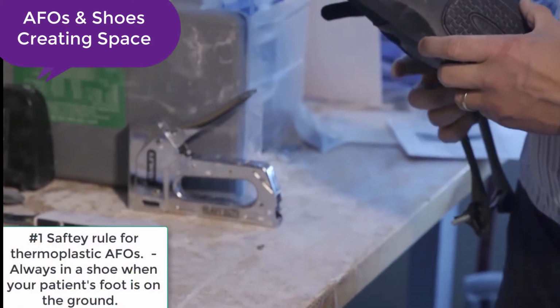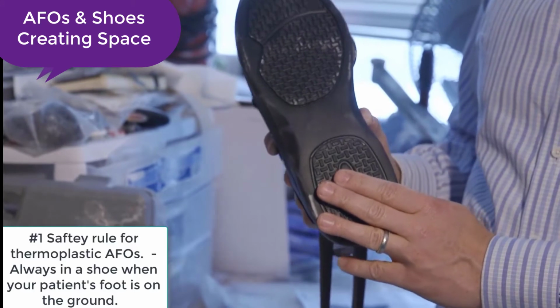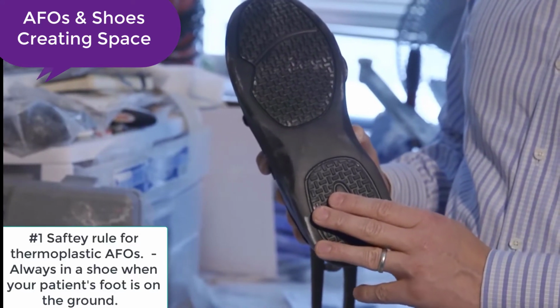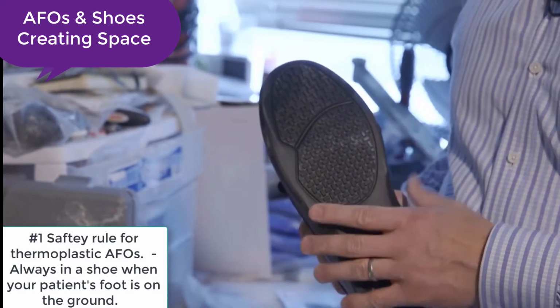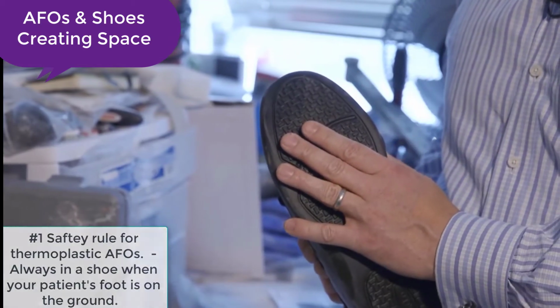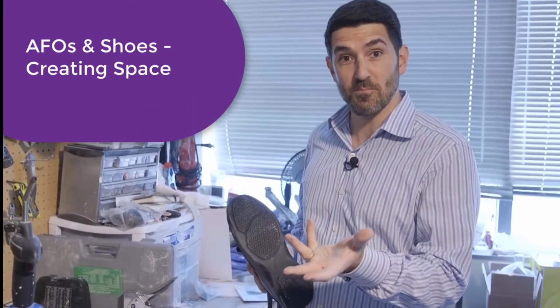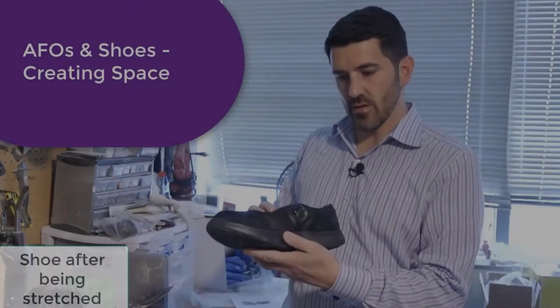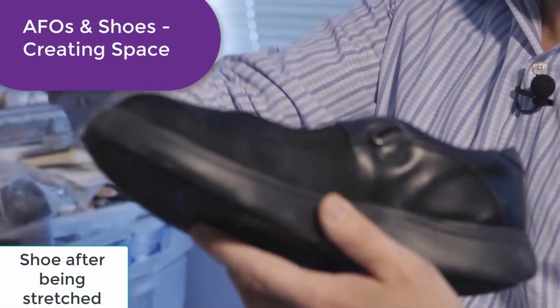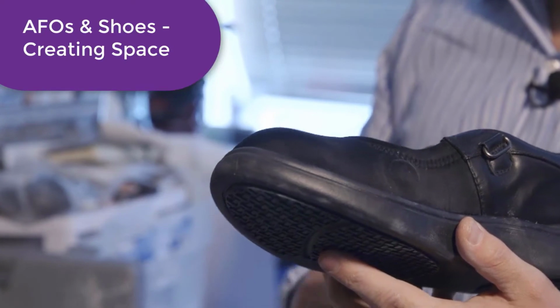The number one safety rule also for AFOs is that they don't have any tread. So the fact that a shoe has tread is a very important concept. This is probably the number one safety rule, because the plastic on the AFO on any surface has very little traction. So you always want it inside of a shoe in most cases for thermoplastic AFOs, and those are the most common types. So just remember, tread inside of a shoe. You can even see it right now, how it just over a couple minutes pushed out that area of the shoe and has now created more room. So the function of it might be better for the patient that way.